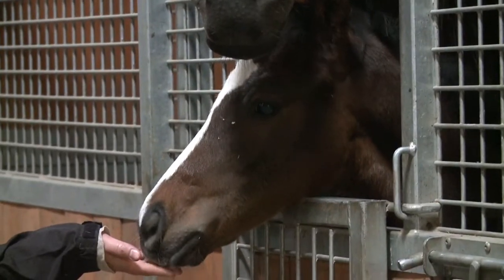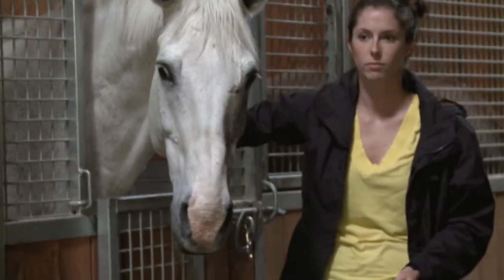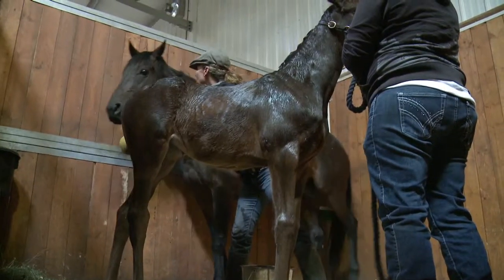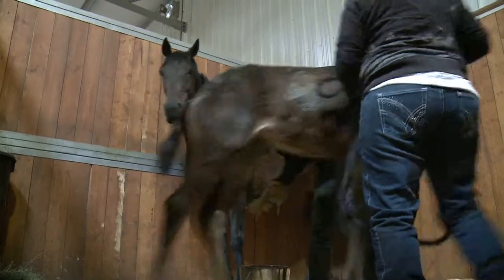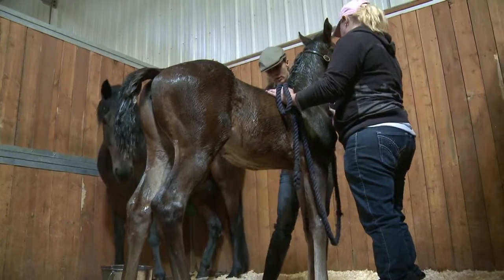Well, again, we used it only for one specific type of problem. We focus really on lung inflammation, lung problems, right? We use horses with normal lungs, and so I wanted to start with the basics: you take a normal horse, put him in a hyperbaric oxygen chamber, what happens to these lungs? What we found, yeah, it seems good. No inflammation, it doesn't induce inflammation. If anything, it may even reduce the number of inflammatory cells in the lungs, so that's all good. We found it's also a short-term effect for oxygenation.